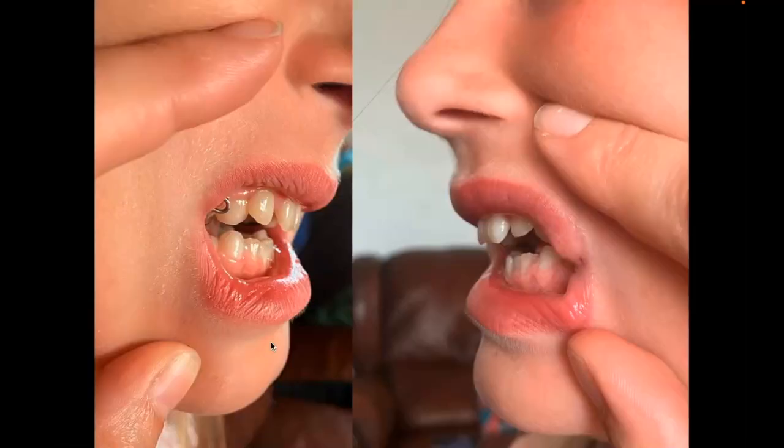And you can see she wore that reverse pull face mask. She wore it well. Granted, she's got the expander in there, so you're seeing an artificial opening of the bite, and as the bite opens, the mandible drops down and back, and so that overjet's going to seem relatively increased. But something to remember, I've never turned a class 3 case into a class 2 case forever. We'll put it that way, okay? Never done that, right?